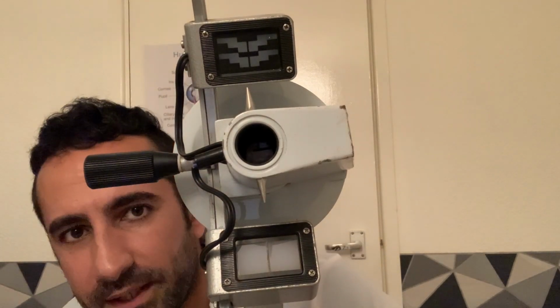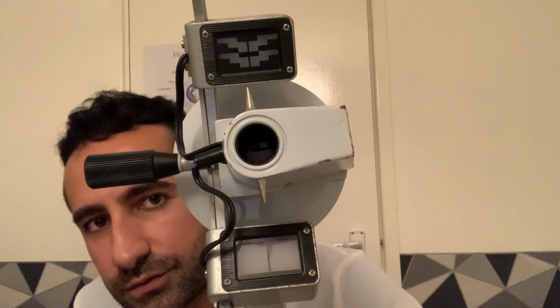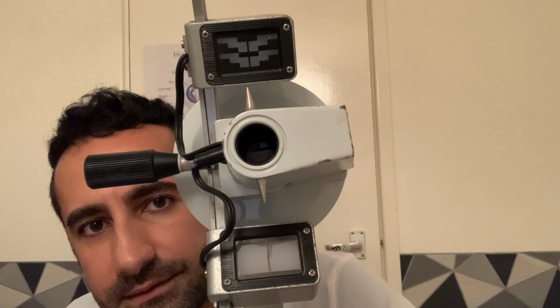So now that we have these readings, what use do they have? Well, we can use them to select a contact lens to go into your eye. So before we pop any contact lenses into your eyes, I want to take some further measurements. Three things. Vertical palpebral aperture, the right eye. Looking into my left eye, 11 millimeters. Right eye now. Okay, and 11 millimeters again.